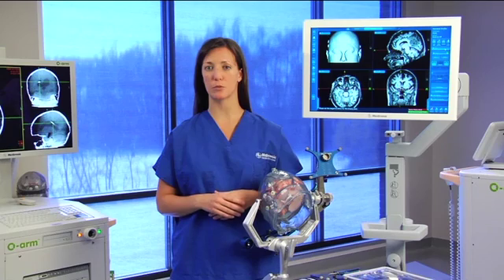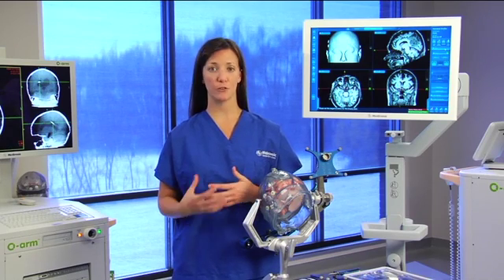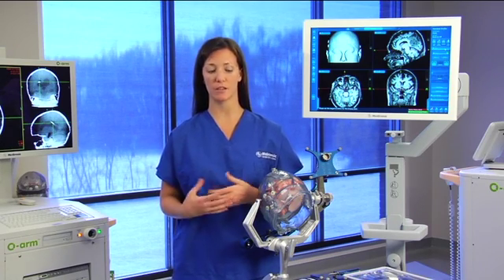I'm going to walk you through doing a biopsy procedure using Navigus. The first step in a biopsy procedure is we want to set a surgical plan.